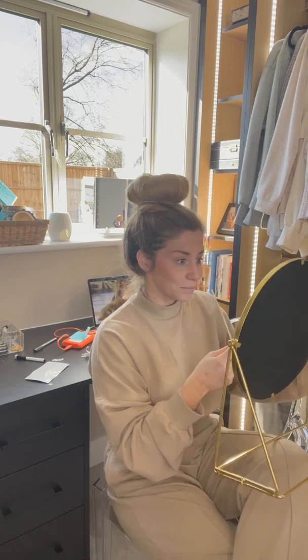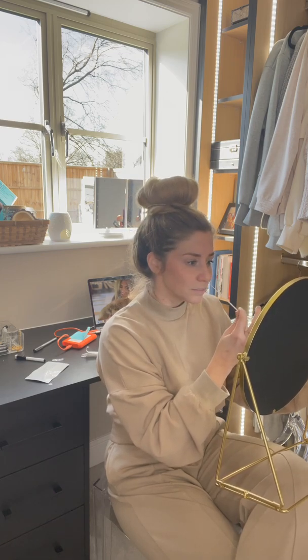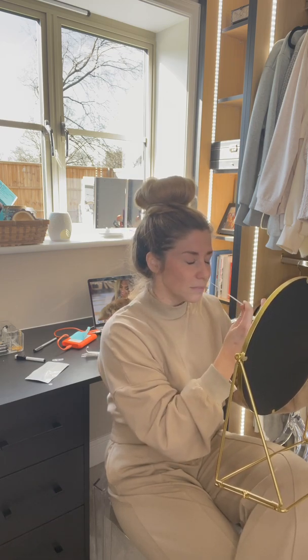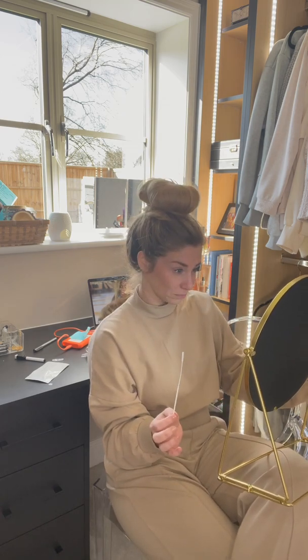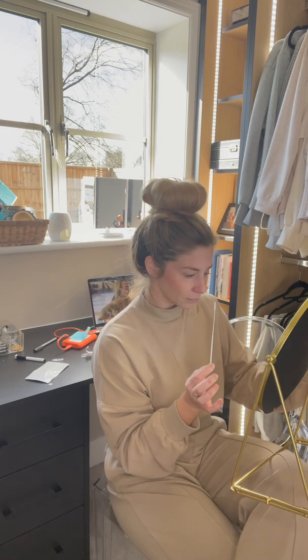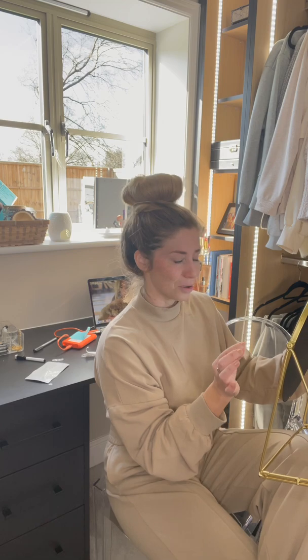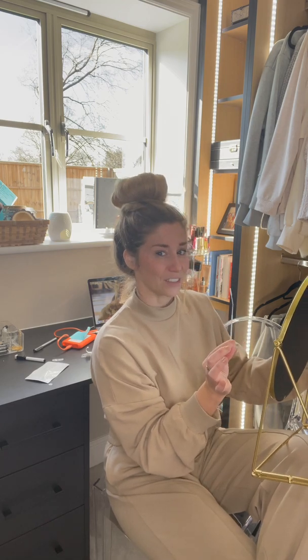I always have to get psyched up for this part. You don't stick it straight up — you have to stick it this way. I feel like I hit my brain. We'll do it one more time. Unfortunately this is a little bit bent for some reason, so I hit it faster than I thought I was going to.